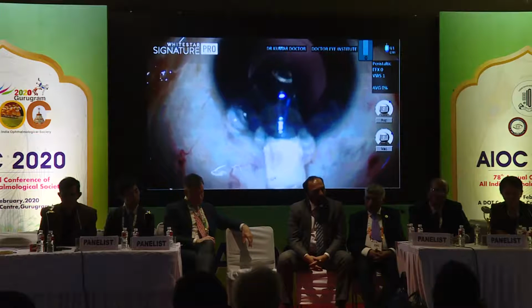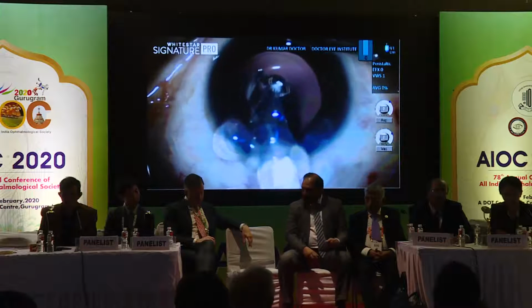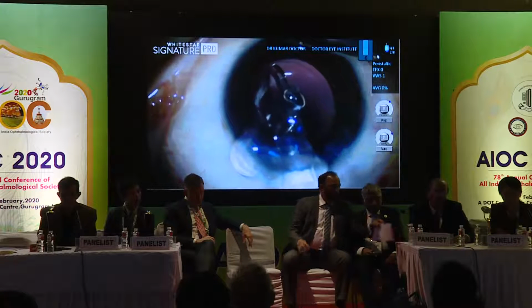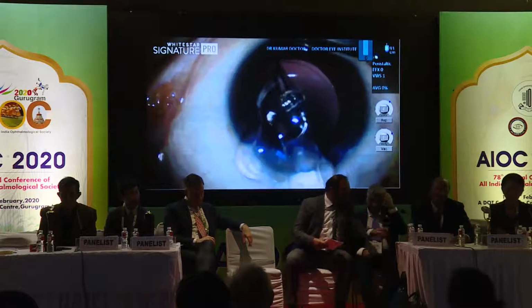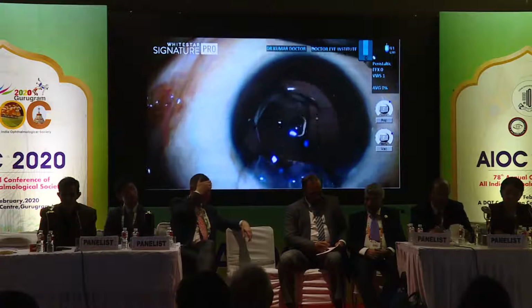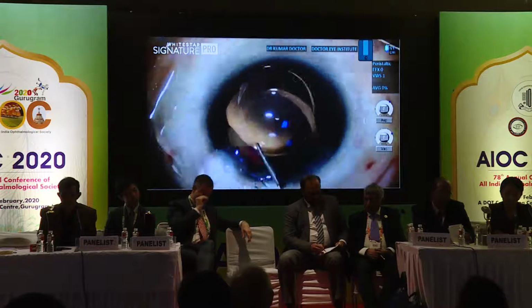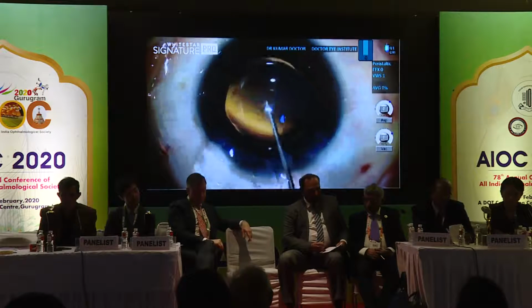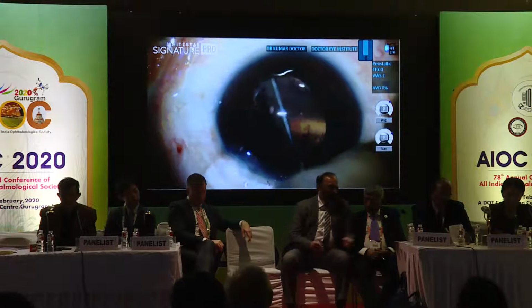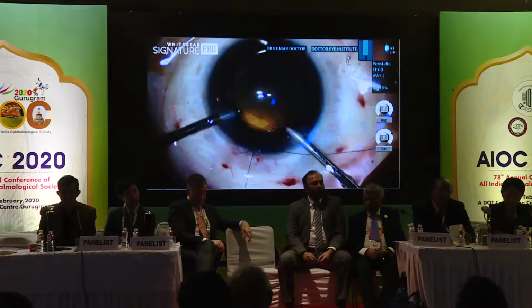Significant amount of pressure needed to push the 1.9 mm thick IOL through a 3.4 mm cartridge. Precaution taken to not let the globe collapse. IOL placed in the bag and the trailing haptic dialed into the bag. Suture placed, bimanual IA done for OVD removal.